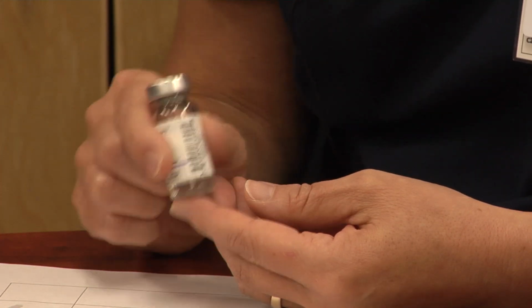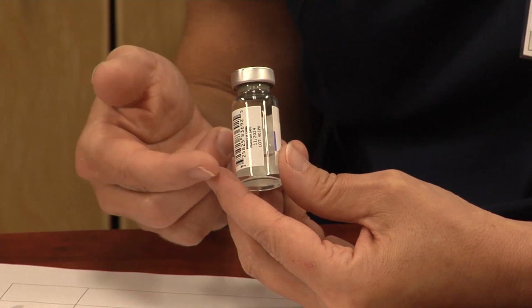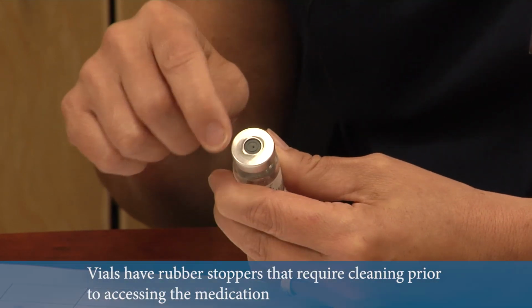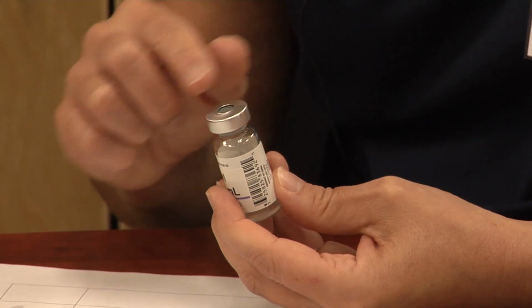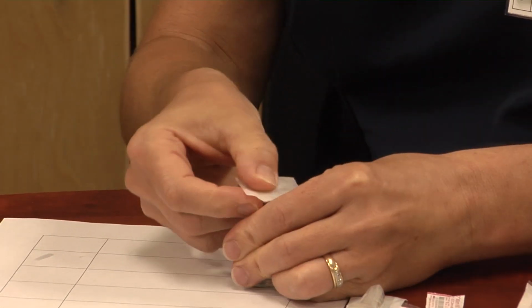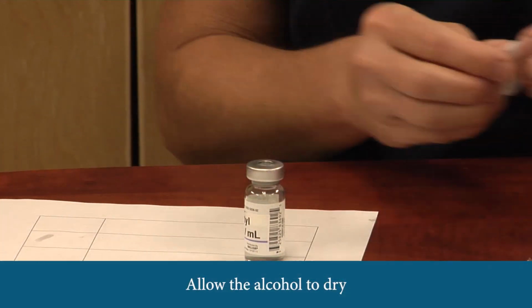Vials are different than ampules in that they can be a larger volume, but not necessarily. There's a rubber stopper at the end, and there's a cap on there. So the cap has to be flipped off. The manufacturer suggests to clean the top with alcohol. Okay. Do that.